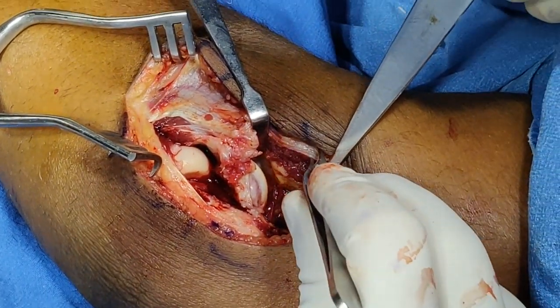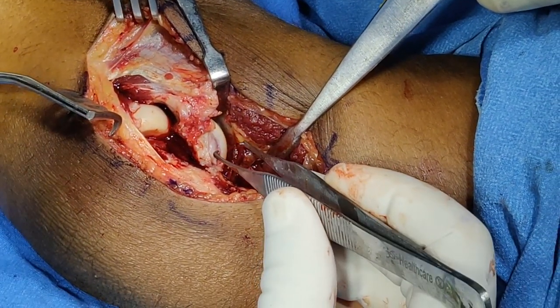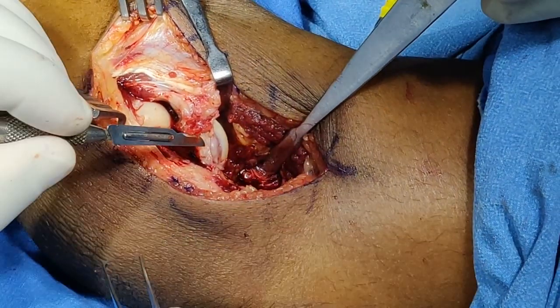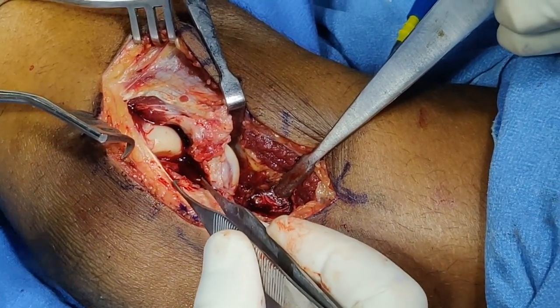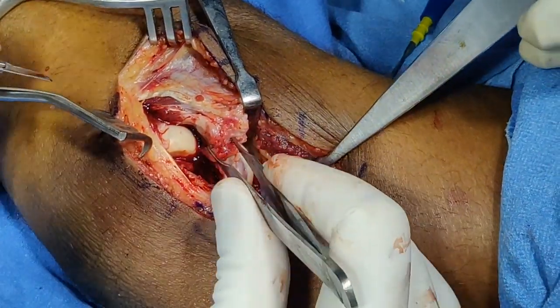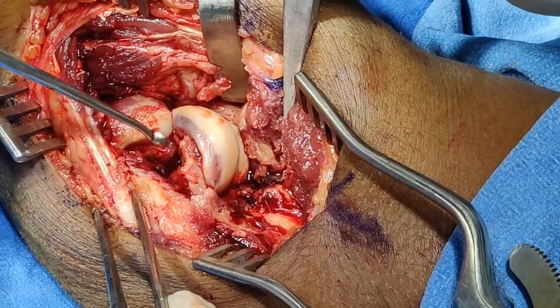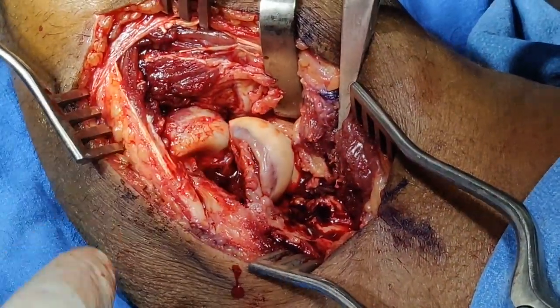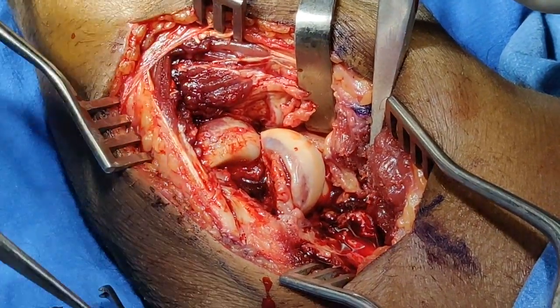Once the flap including the common extensors and part of the capsule is raised, I have started seeing the capitellum. There is some fibrosis because this injury is 15 days old — not a fresh fracture. I have released the scarring and you can see the capitellum here. We need to identify it, reduce and fix it, but first we need good exposure. I am going to use a curette to freshen the edges of both the anterior surface of the humerus and the posterior surface of the trochlea and capitellum.